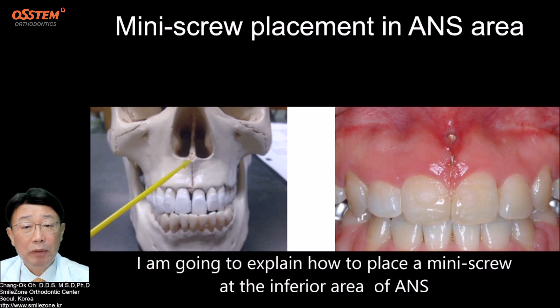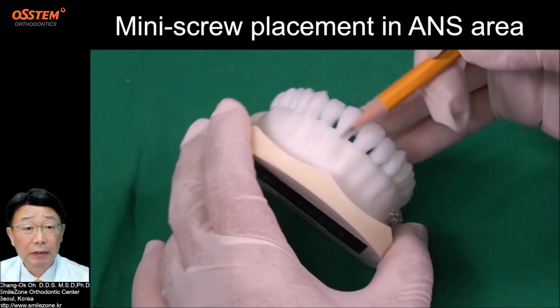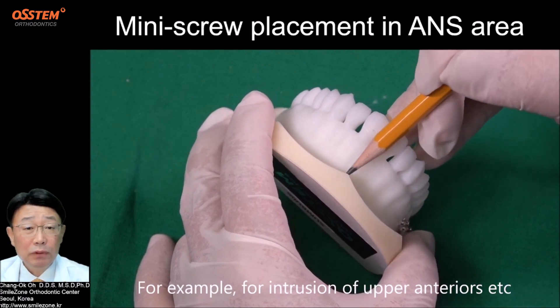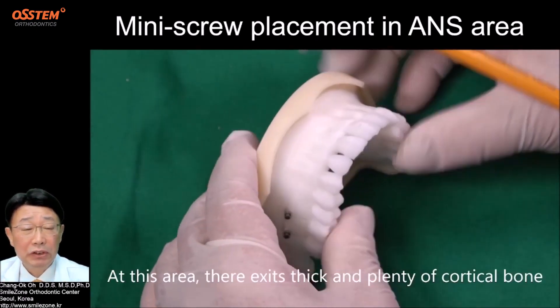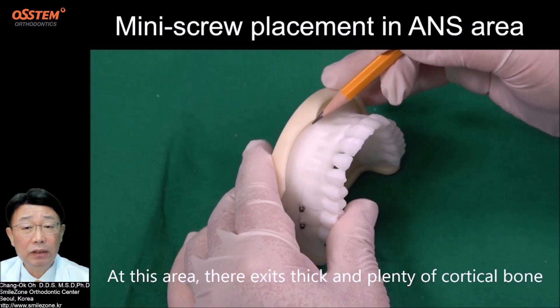I am going to explain how to place a mini screw at the inferior area of anterior nasal spine — for example, for intrusion of upper anteriors. At this area, there is thick and plenty of cortical bone.